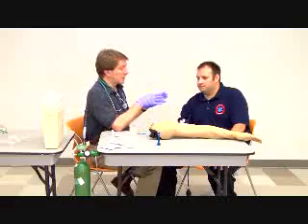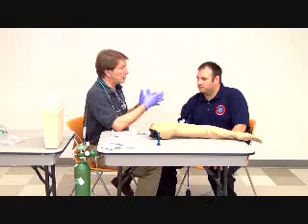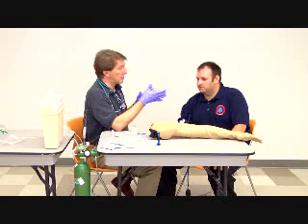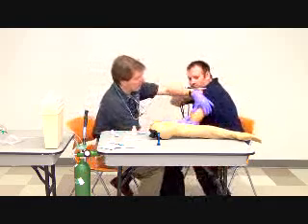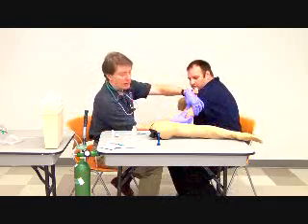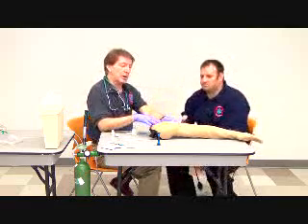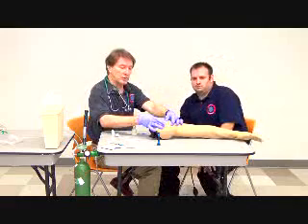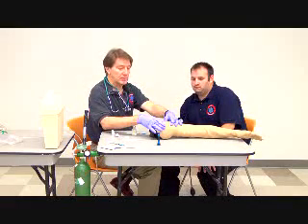I'm going to explain next to the patient what's about to happen, which is, sir, we're going to administer some epinephrine. This will help you breathe and help your blood pressure get back up a little higher. We're going to shoot it into your arm, and actually we're going to inject it back here in the posterior aspect of the arm, roughly in this area. Now this injection mannequin, you can't inject it at that point, so we're going to inject it up here where you normally would inject an IM medication.